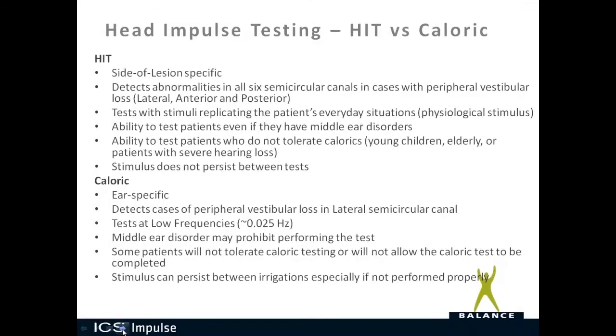Let's quickly talk about the difference between head impulse testing and caloric testing. Head impulse testing, again, is a site of lesion specific test. So it's going to tell you whether it's the left lateral canal, the right lateral canal, the left anterior canal, the right anterior canal, etc.